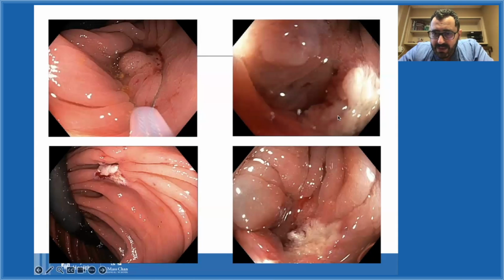But when he looked more closely, there was a growth inside the diverticulum. A diverticulum is the singular of diverticulosis. You probably heard the term diverticulosis a lot. A diverticulum is basically an outpocket in the colon, probably just like this one over here on the left side. So when the polyp grows into the diverticulum, removing it with a snare becomes difficult and becomes risky.